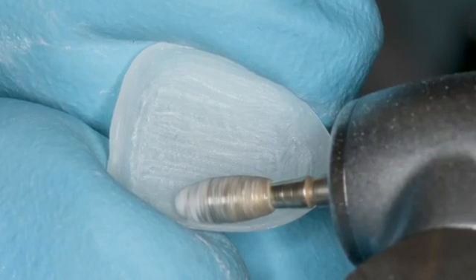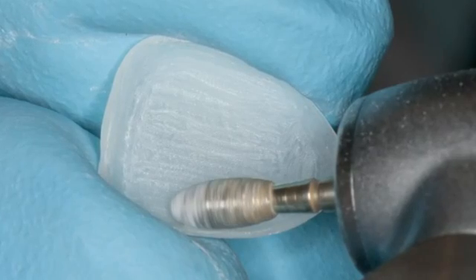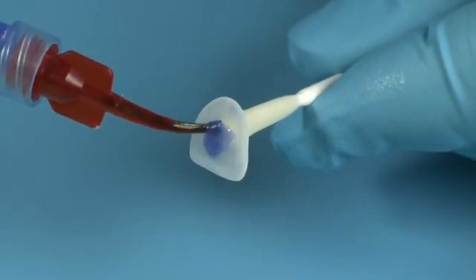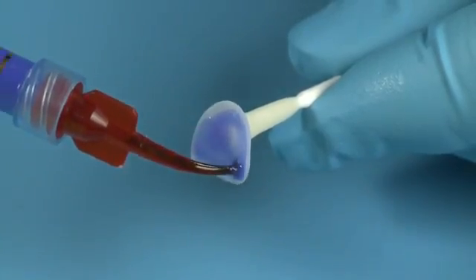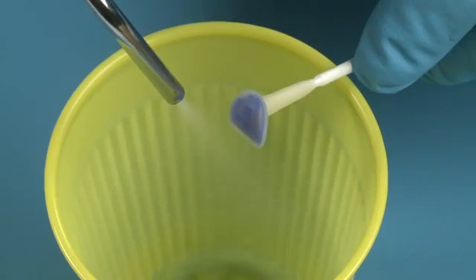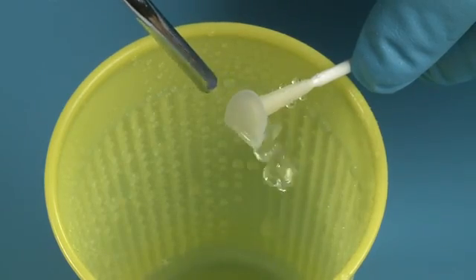Roughen the inner surface of the Edelweiss composite veneer using an air abrasion unit or a diamond burr to prepare the veneer for bonding. Clean the inner surface of the Edelweiss composite veneer for five seconds with Ultra Etch. Completely rinse Ultra Etch from the Edelweiss composite veneer. Then dry the veneer, leaving it slightly damp.